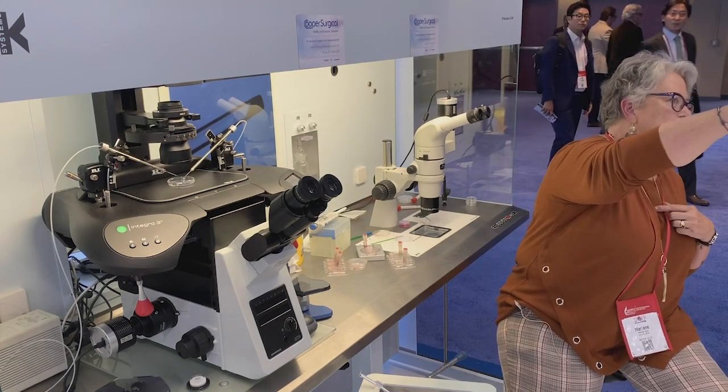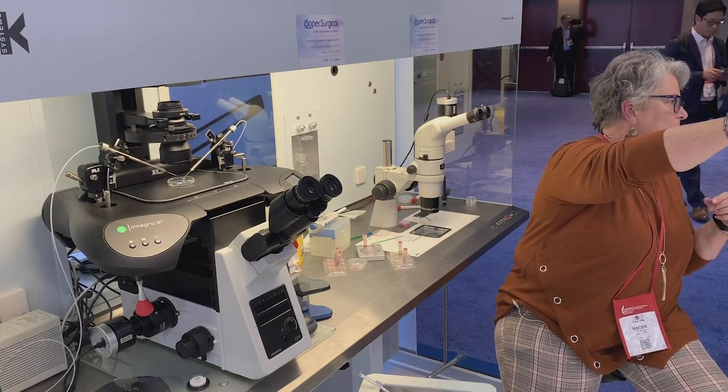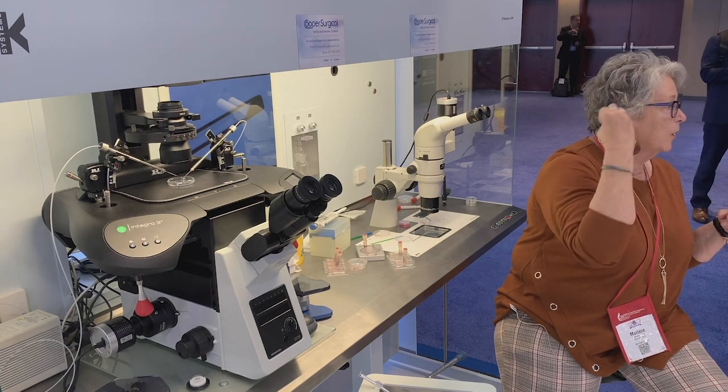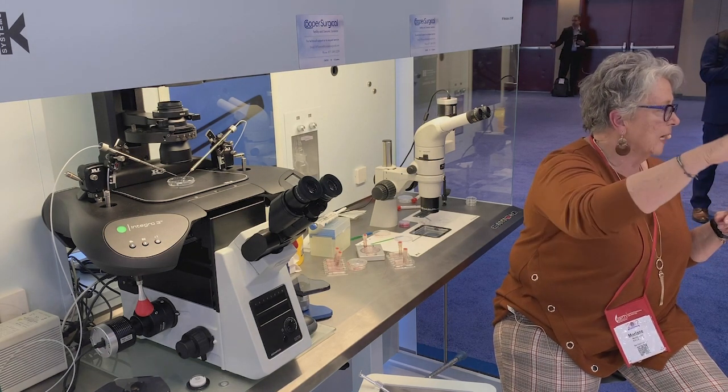Now, because I already touched it, there was already a little bit of fluid on there. With a drop this big, I would go in and pull a little bit off of that, because that's a big drop.